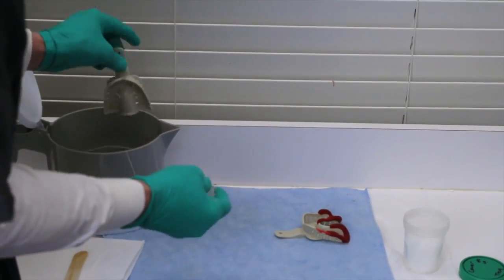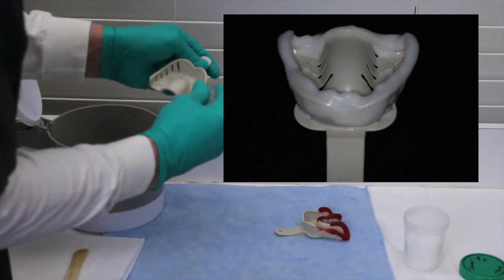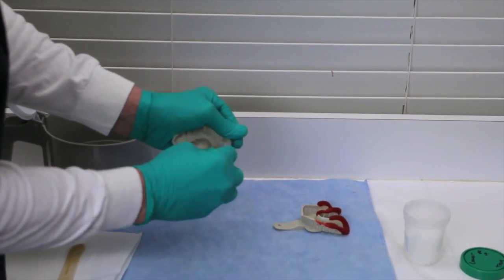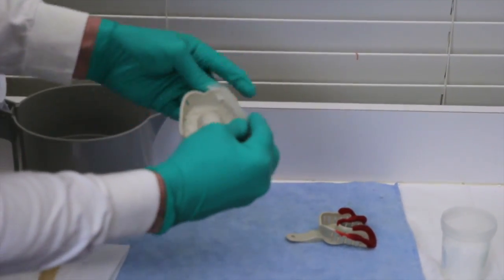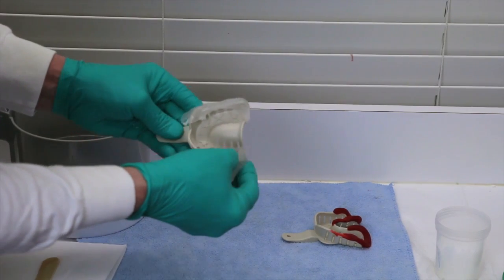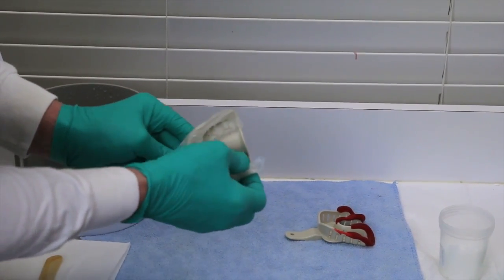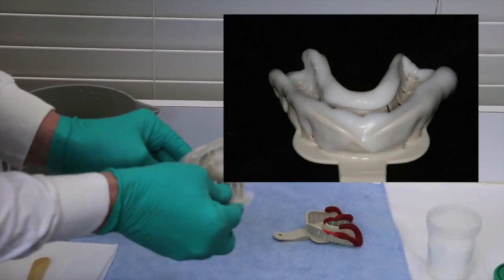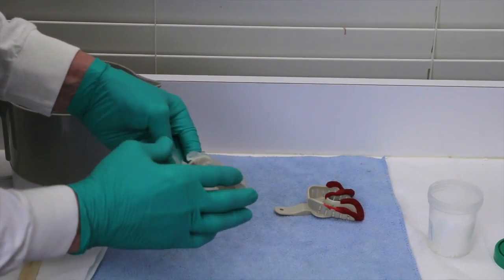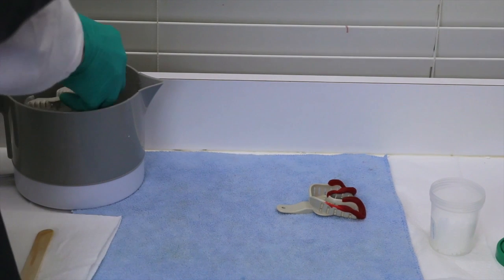We can take that material and border mold as we need. I'm being very generous on the molding here, and we'll trim that down. This stuff is very, very sticky, as I think you can get a sense of here, and it's actually sticking to my gloves. We can take this and put it back into the water.